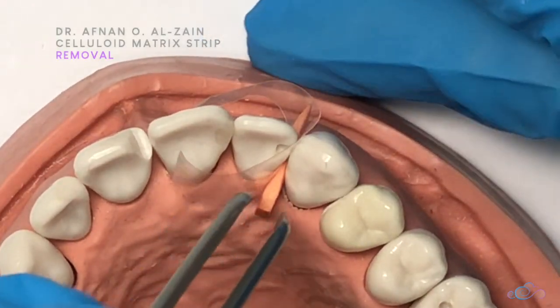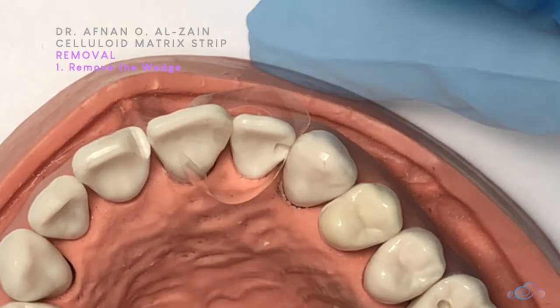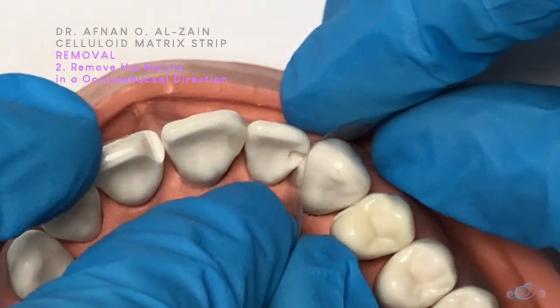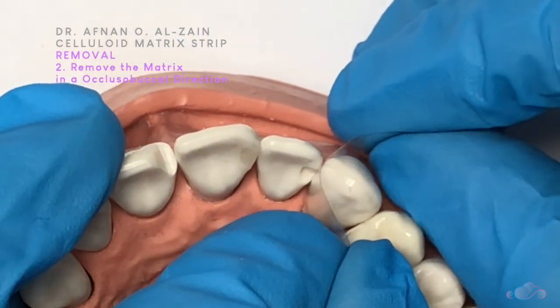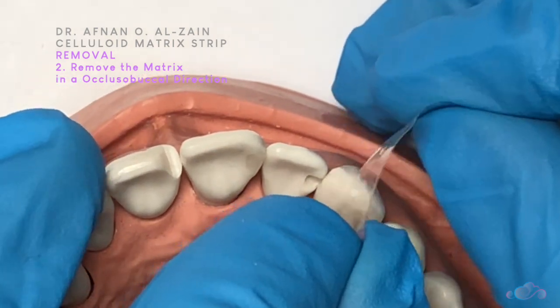How are we going to remove it? The same as the metal matrix — we're going to remove the wedge first. Then slowly, we remove the matrix in a diagonal position, moving it closer and closer until it's free.